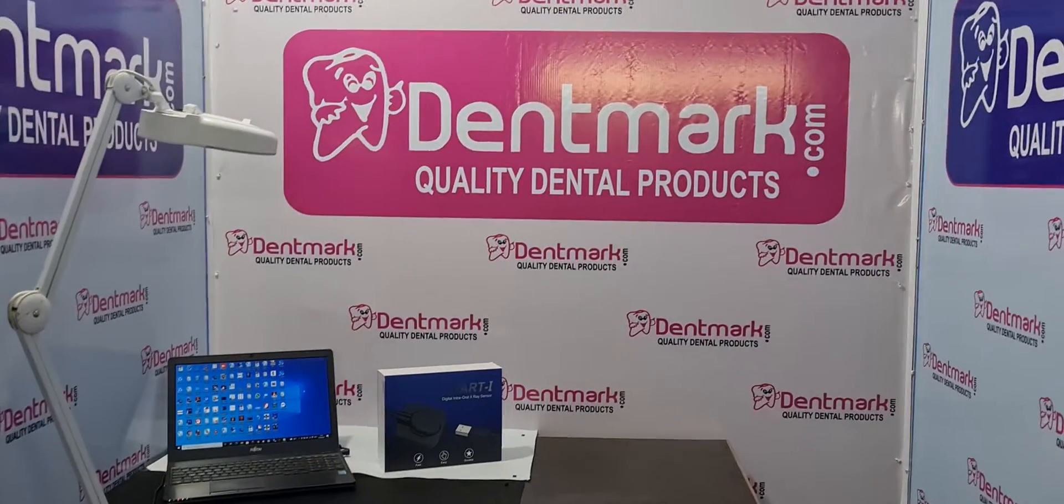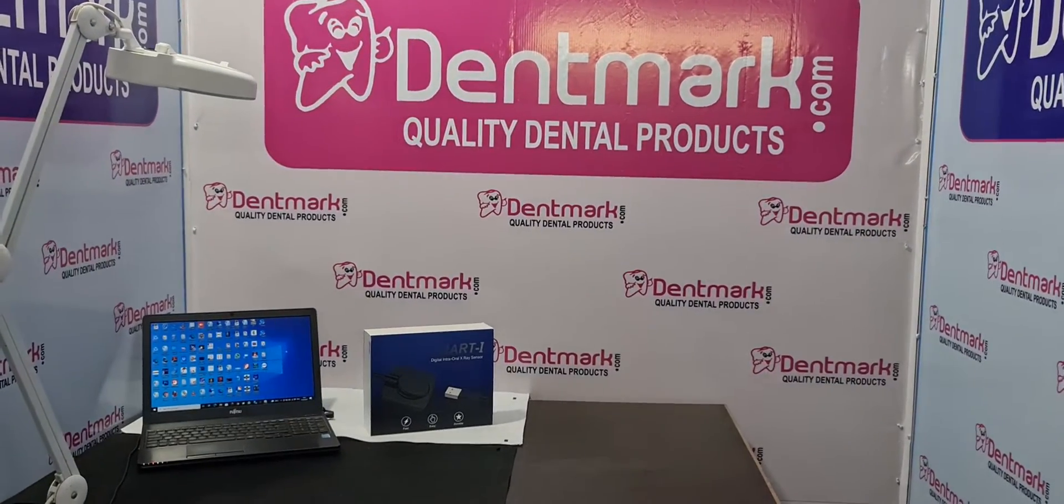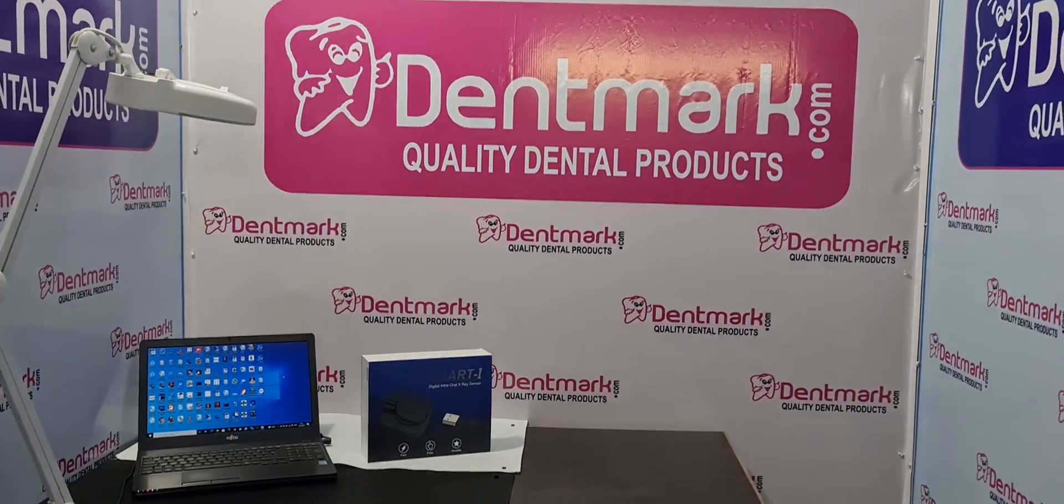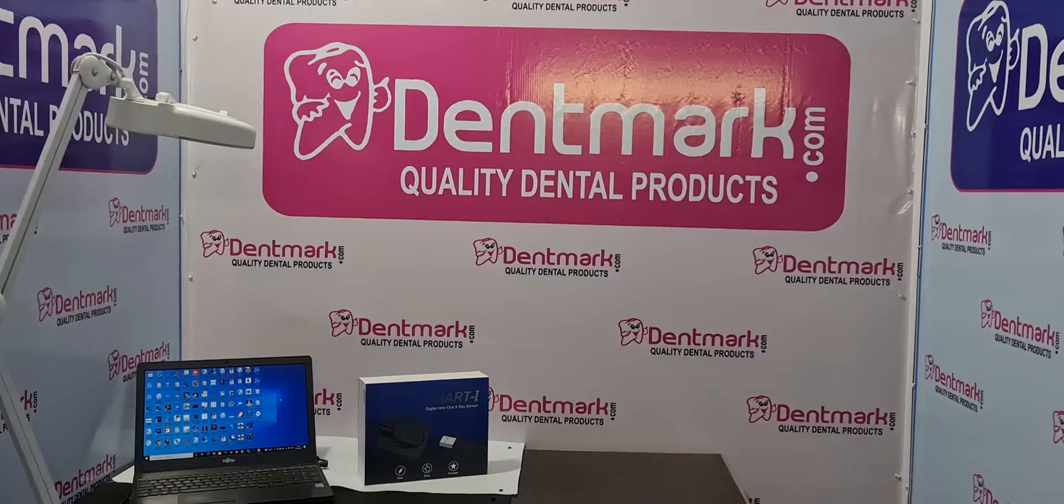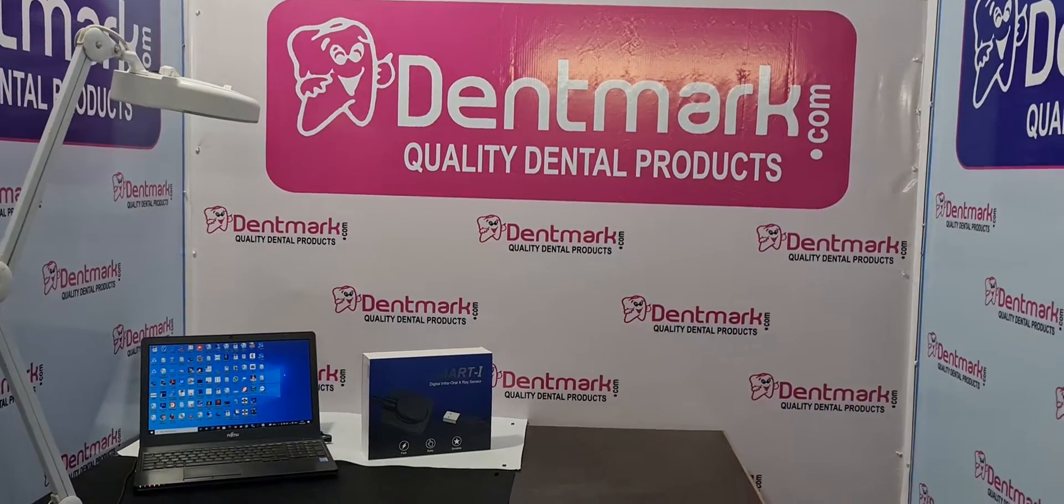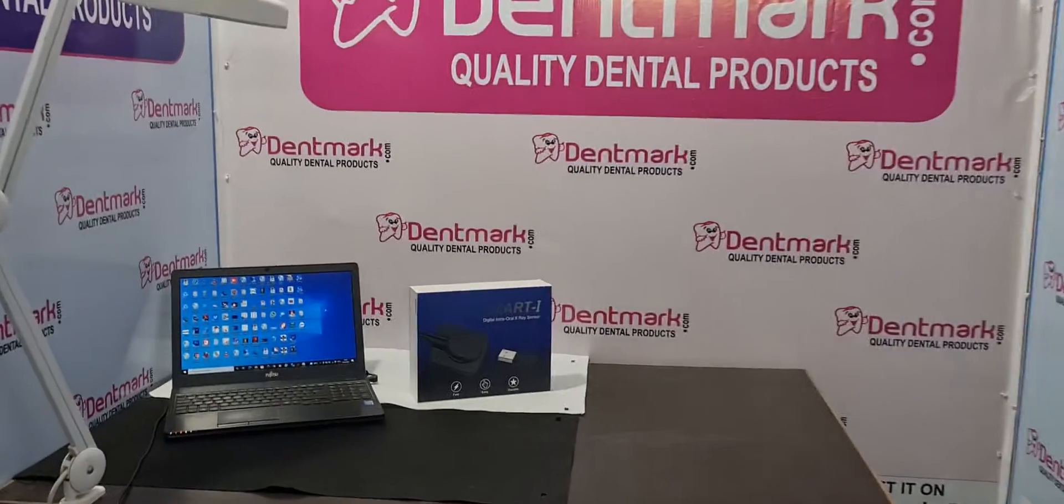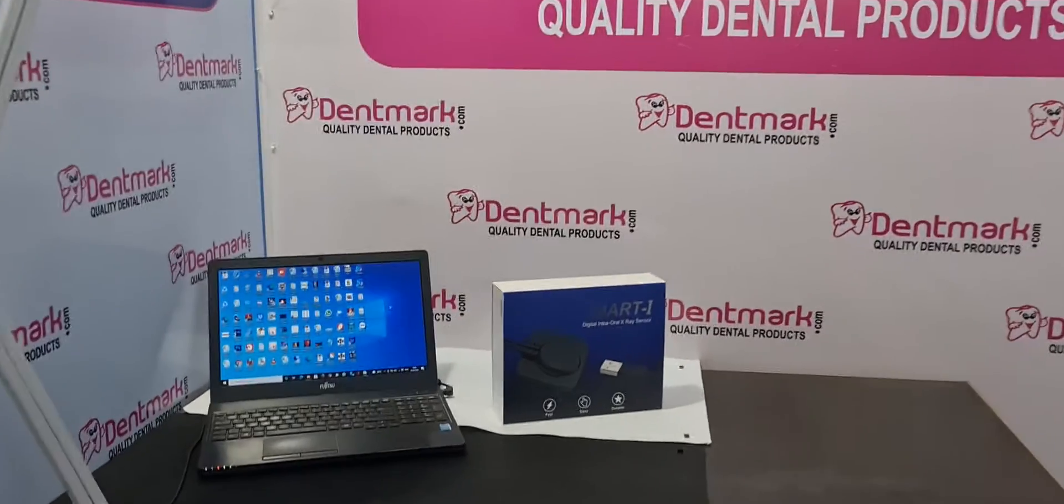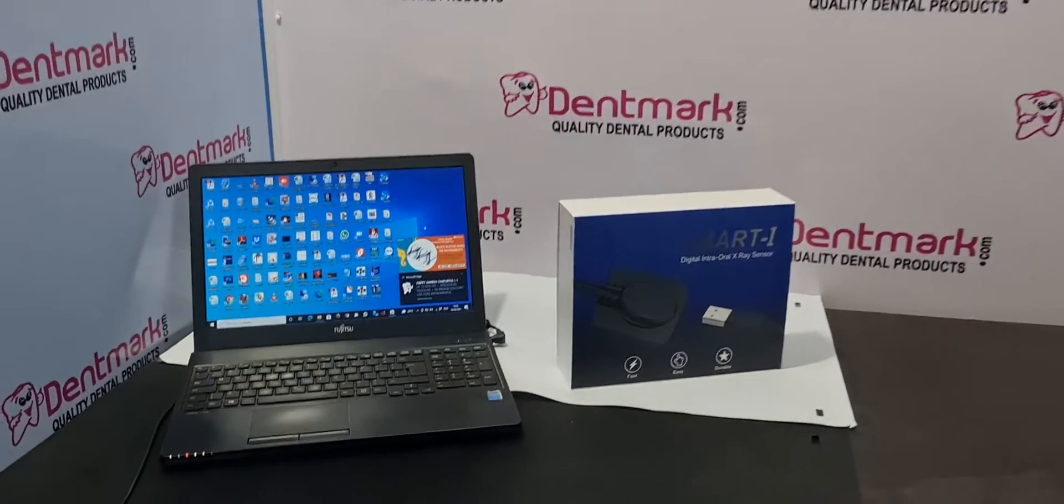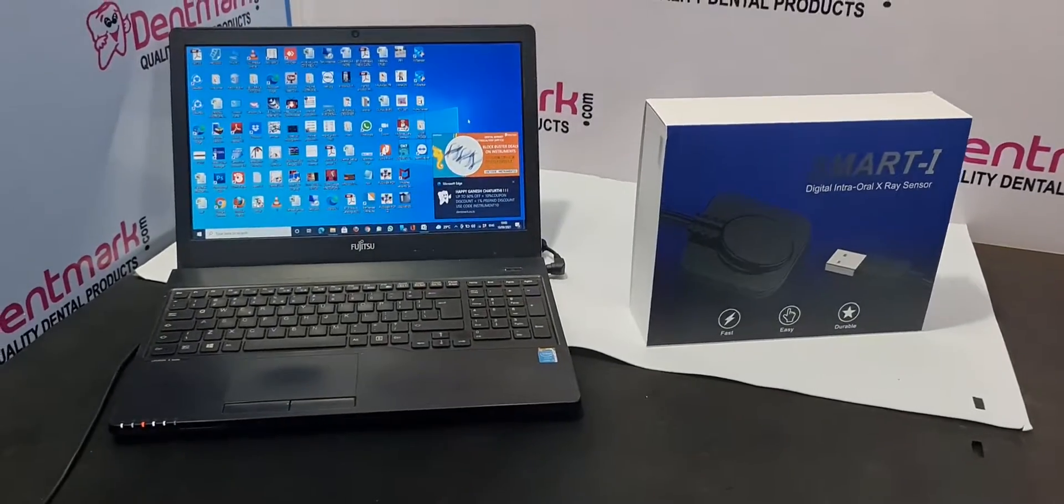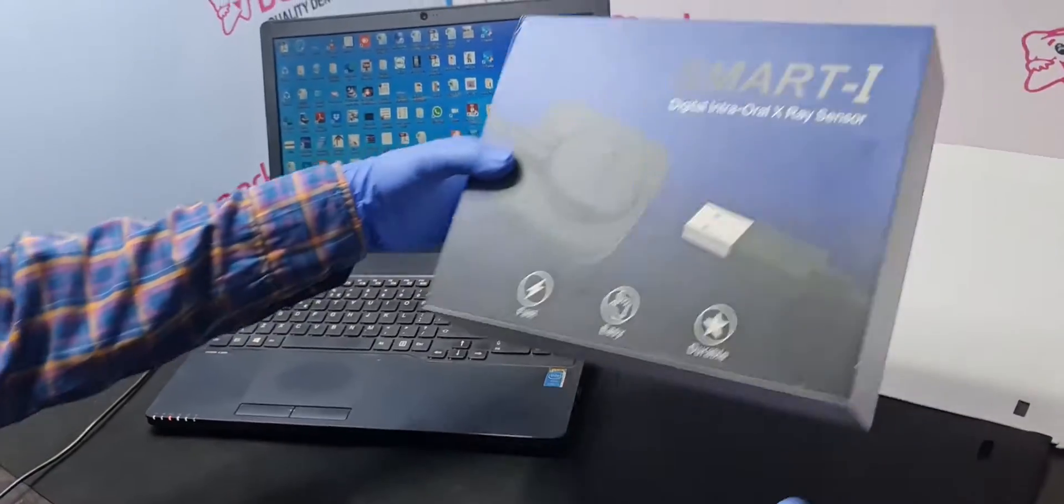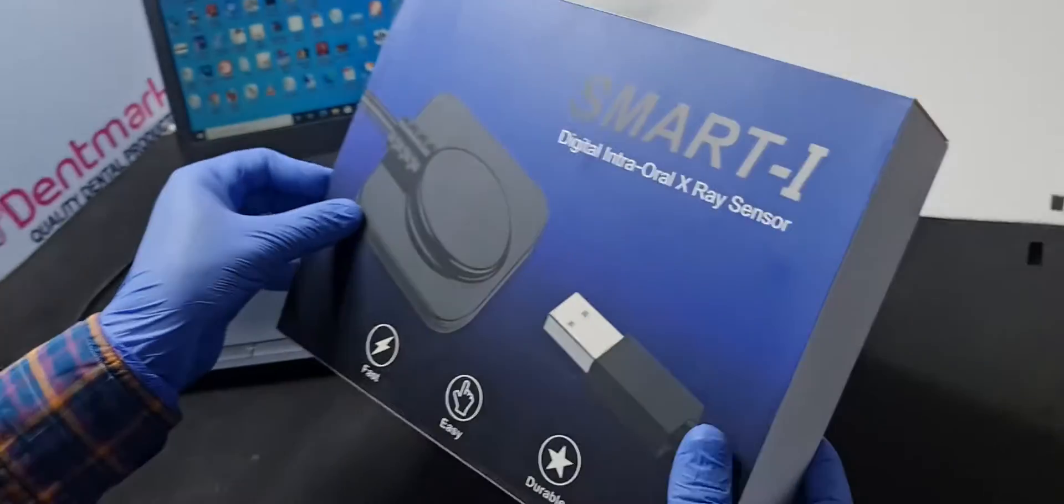Friends, here Dentmark will show you the live demo of RVG, that is Smart-I by Dentmark, and also will tell you how to install the software, how to do the settings, so we will tell you how to unpack.